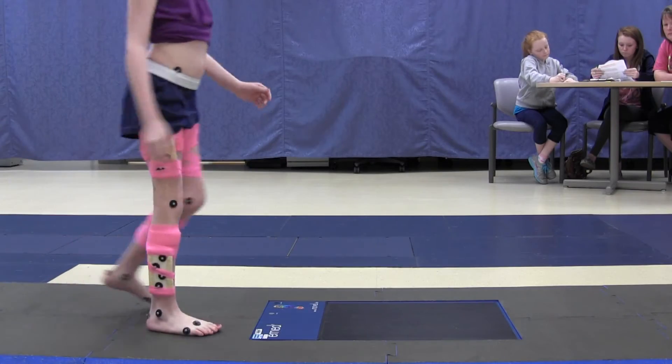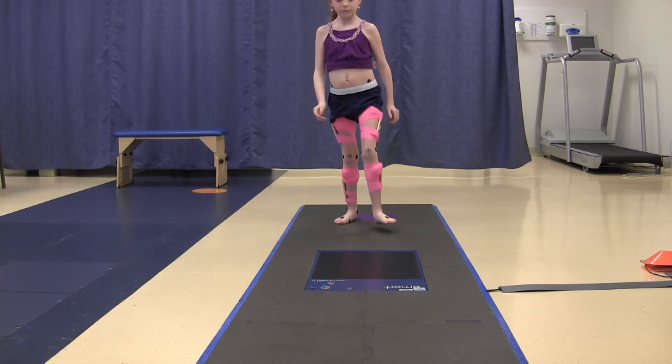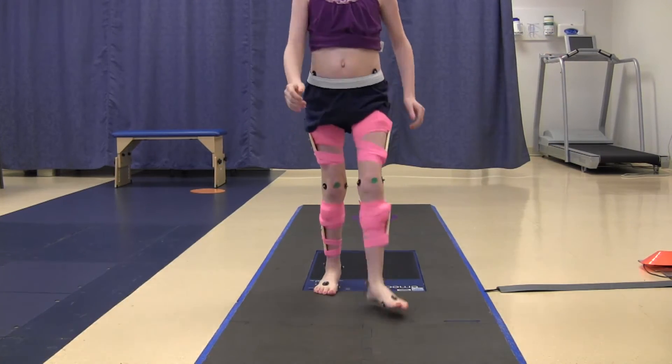Next, if the doctor wants to measure my footprints, I will walk on a special squishy mat. I will wait for the lab assistant to tell me when to go and start walking.